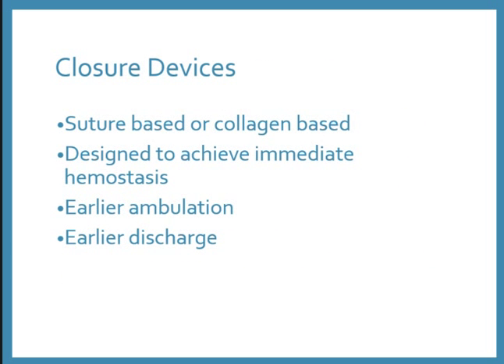There are what we call closure devices. They are suture-based or collagen-based. They're designed to achieve immediate hemostasis. It allows them to ambulate earlier and to be discharged earlier.